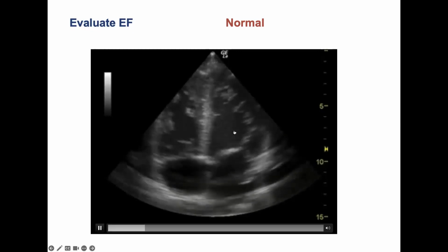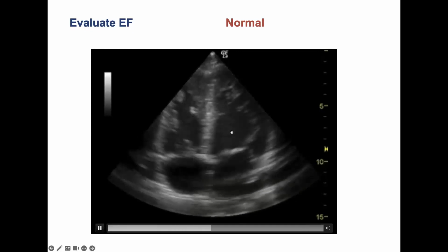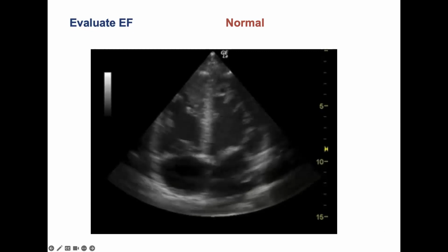Now, luckily, we can also here evaluate that endocardial excursion. If I put my cursor in the middle, the walls are moving in, and I can also see myocardial thickening. The walls are thickening with contraction.